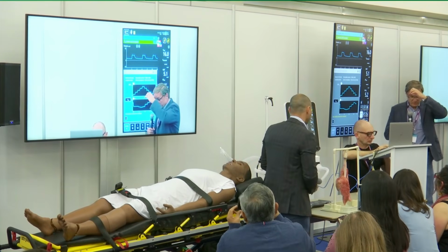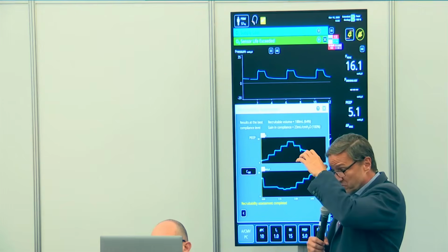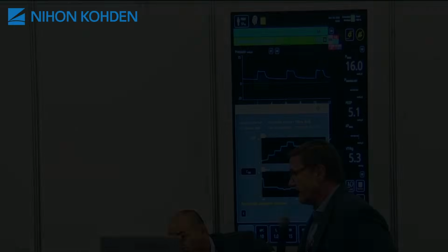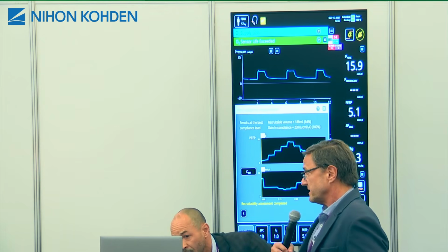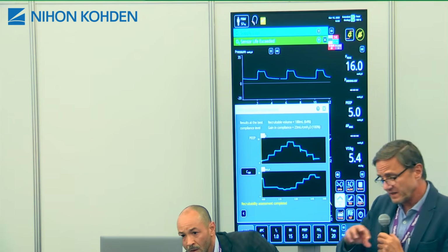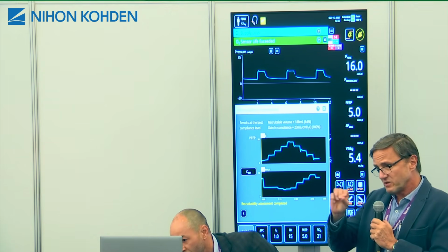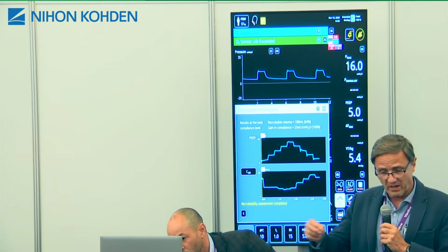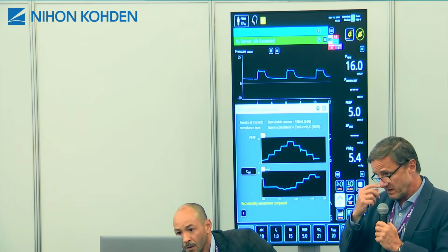We did an experimental study to prove these measurements. And the idea is that first we did a CT study and then an EIT study trying to relate the amount of collapse and the change in compliance that you have with this maneuver.